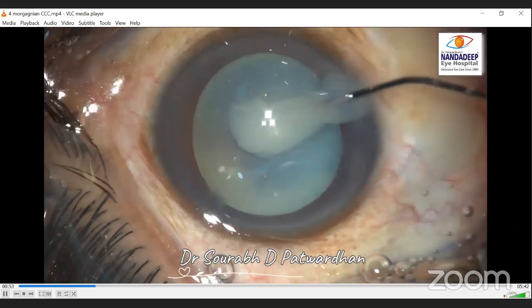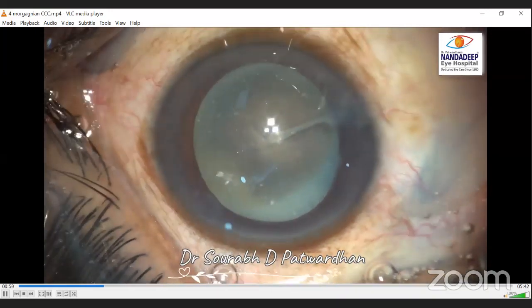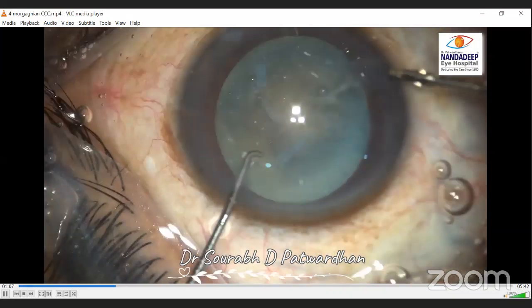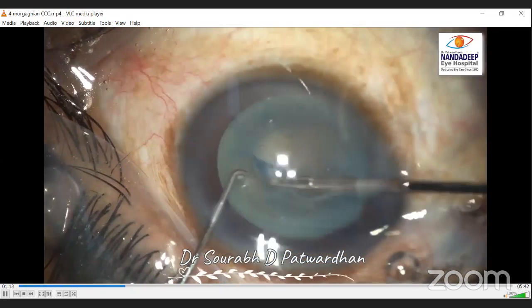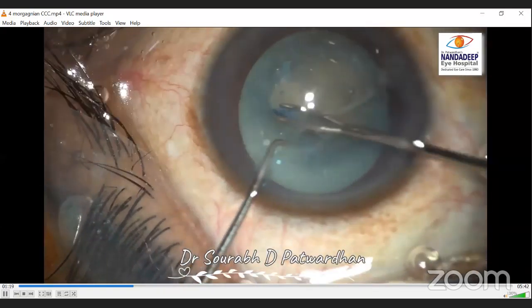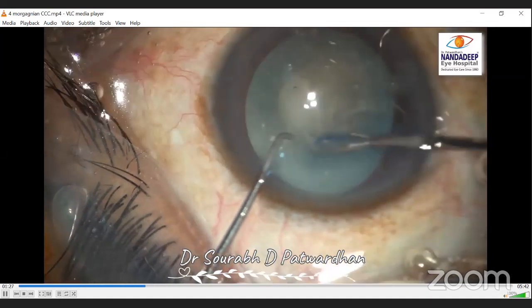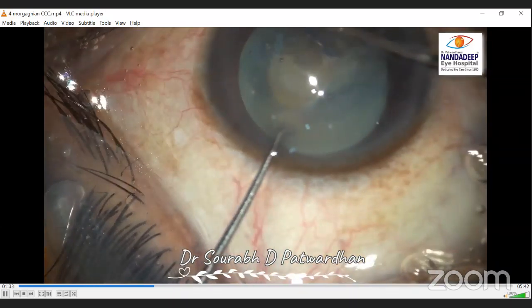The capsule is sometimes brittle and the cortex is all liquefied. You can see the nucleus is shrunken. Here, my choice of instrument is microcapsulorhexis forceps. Of course, you can use the regular capsulorhexis forceps. And here, I want to show you the principle of shearing. See, I am moving my forceps tangentially, always tangentially. So the shearing force is used and not the tearing force. This is very important, particularly when the zonules are weak.